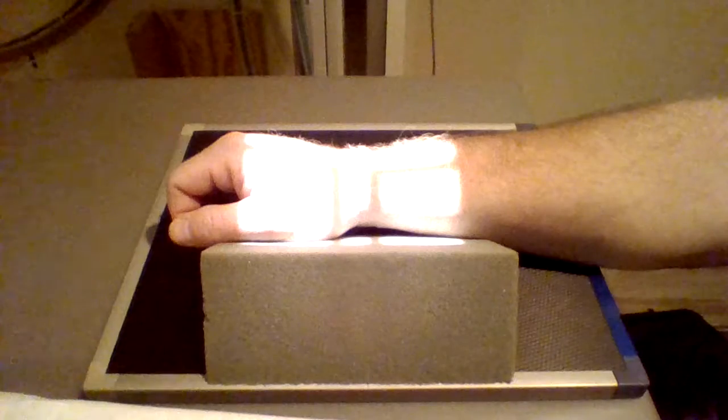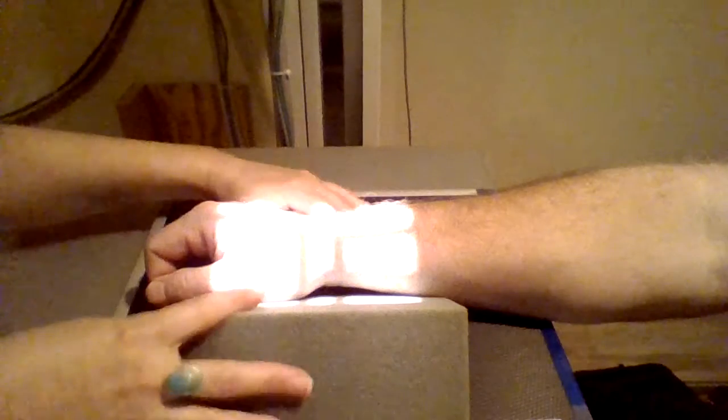Make sure you have everything all nice and lined up. We're at a good 45-degree oblique. You're going to place your marker, and you're going to take the shot. Beep. You're going to take the cassette out. Place a new cassette, 10x12. And we're going to do a medial oblique.